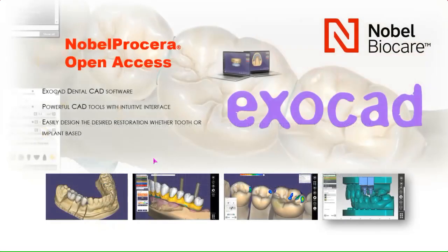Now, as I mentioned, exocad is a powerful design tool software that we now have available through Nobel Biocare for NobelProcera restorations. And you can get this directly through Nobel Biocare in your local areas from your local representatives. And if you don't know those people, please let us know, and we're happy to get that information for you.